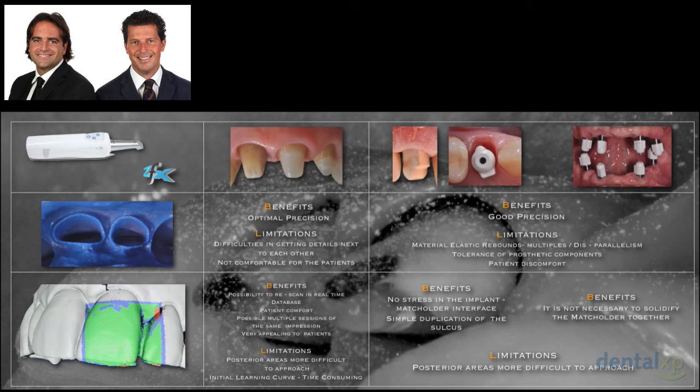if there is something that we don't like. This is something that is not possible to do with the traditional approach. We increase the patient comfort, and in the modern treatment plan approach, in which our patient is in the middle of the treatment plan, it's important. We have the possibility to have multiple sessions of the same impression, another thing that is not possible with the traditional approach. And what we saw is that it is also very appealing to the patient.